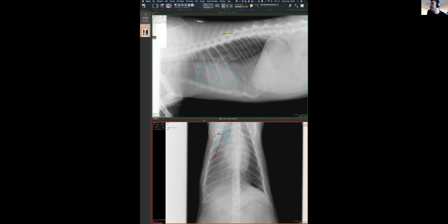And when I zoom in on my big screen, that's making me think, thinking about it now, I guess if you had really bad atelectasis, that could cause that as well. So if there was some sort of pathology outside of the lung that was then compressing the lung, I would buy that explanation. But that's sort of where I'm at in my mind.